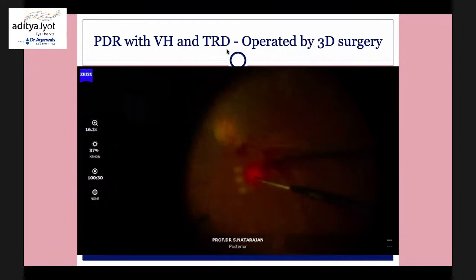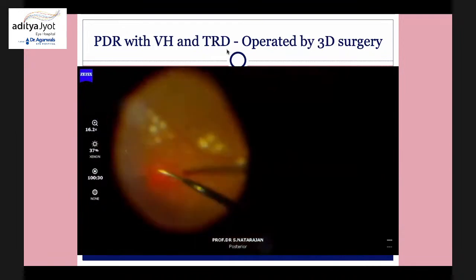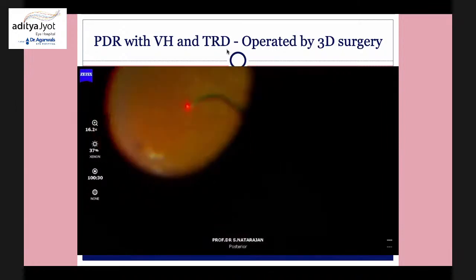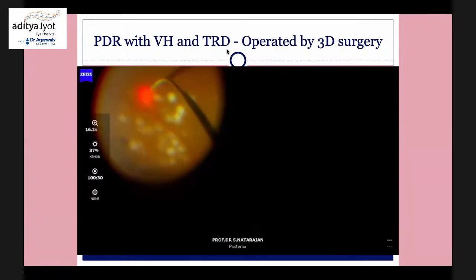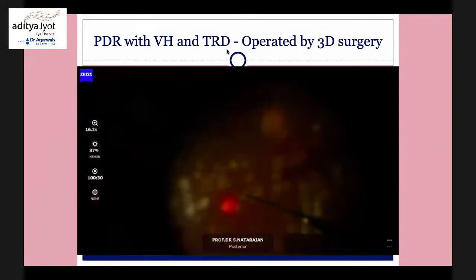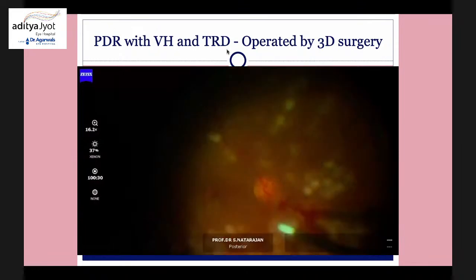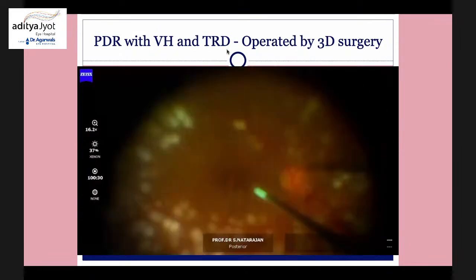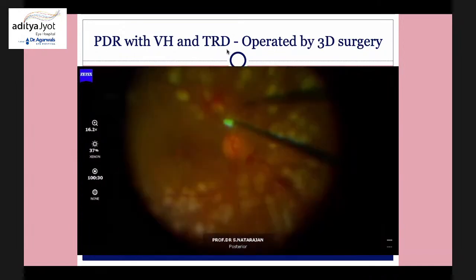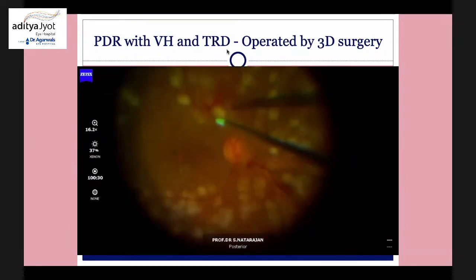The idea is to totally free the retina from traction and do a panretinal photocoagulation, maybe 1,000 or 2,000 burns. Most of the patients in India are not done laser. The reason is they somehow don't understand that if you're a diabetic, you don't have to wait for the vision to go down. You have to come to the doctor when the vision is normal. The problem is everybody wants to come late. So by the time the vitreous hemorrhage happens, there's no laser done. And if they don't come in time, they still develop traction detachment. And you can imagine these sorts of eyes can get 6/6 vision post-vitrectomy.